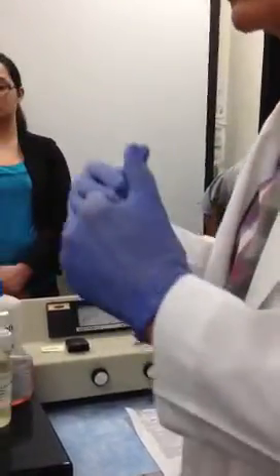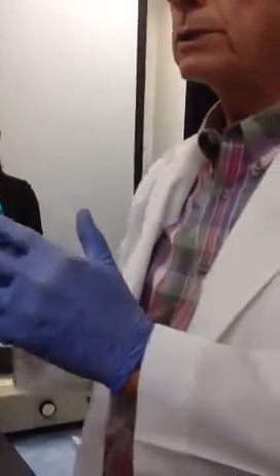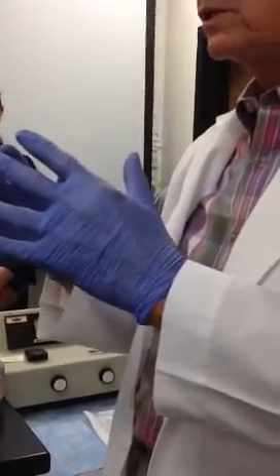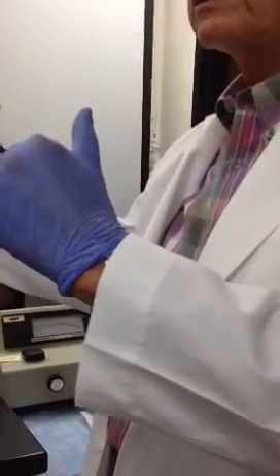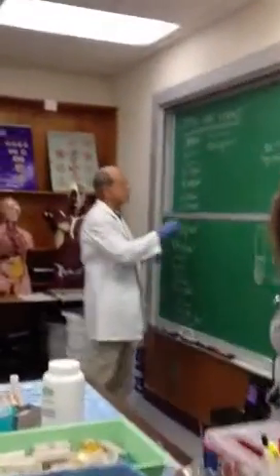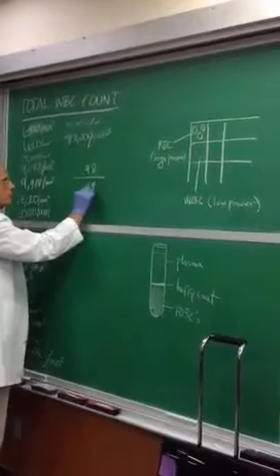All right? So how are we going to then come up with a number for the concentration of cholesterol in our patient? Do you just divide one by the other? No. Well, we multiply the ratio times 200 milligrams per 100 milliliters. It's on your handout. I should have had you bring your papers up here. But when you work this, you've got a ratio here. 0.98 is the patient. You put that on the top, and down here you put 0.48.